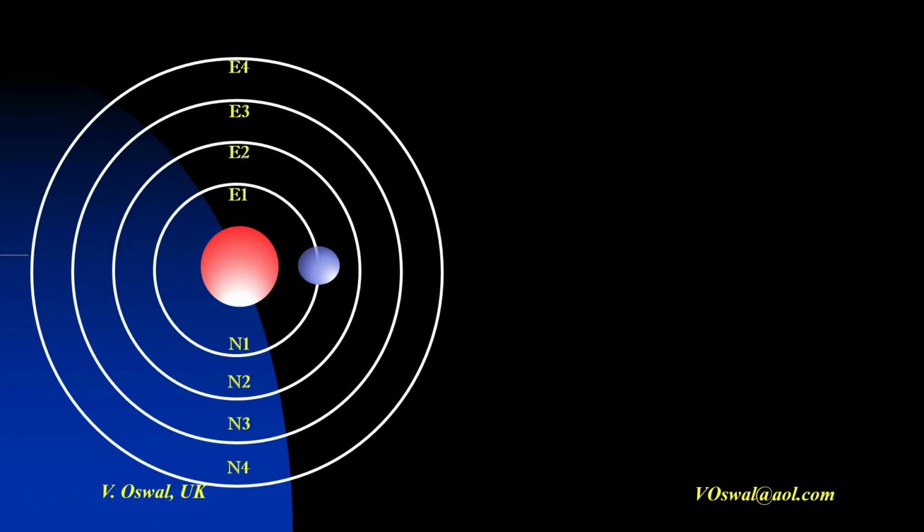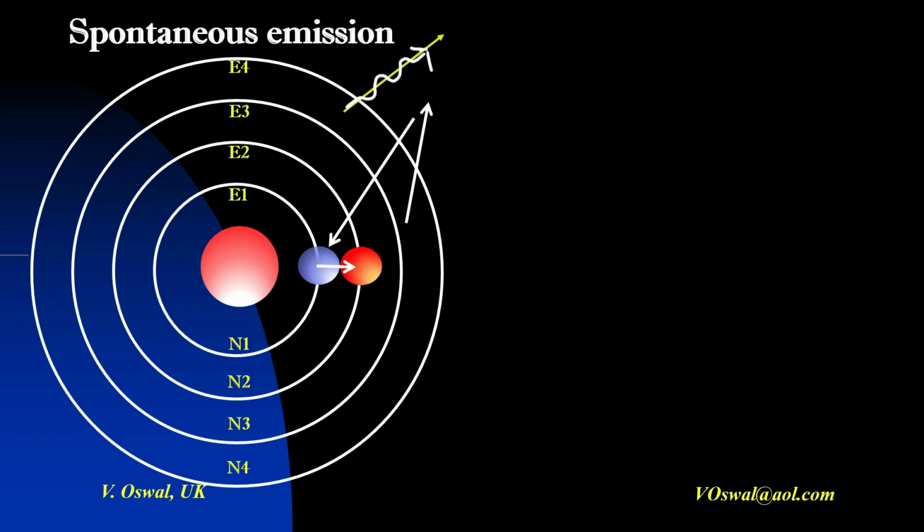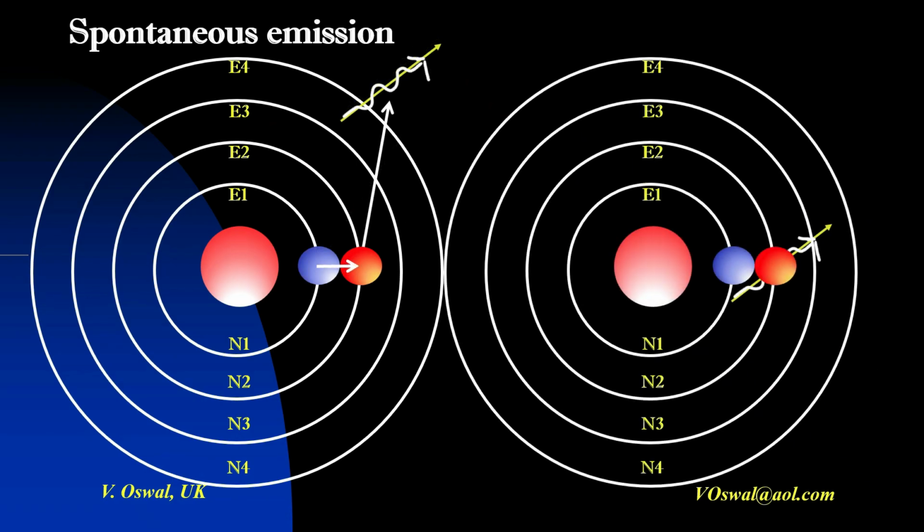When an electron spinning at a ground level is energized, it jumps to a higher energy level. Here, it is unstable. It therefore emits its energy as a photon and decays to a stable ground level. This type of emission is known as spontaneous emission. But if an electron, already at a higher energy level, is further energized, it jumps to an even higher energy level.